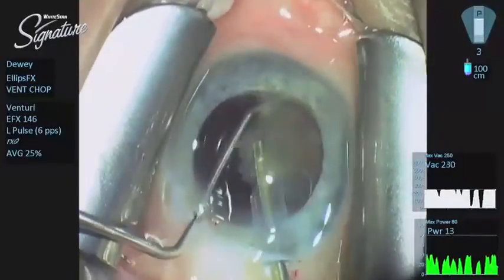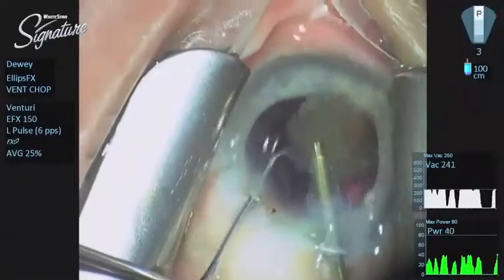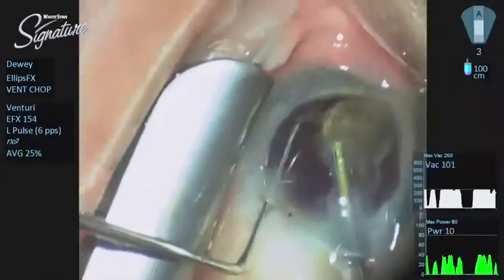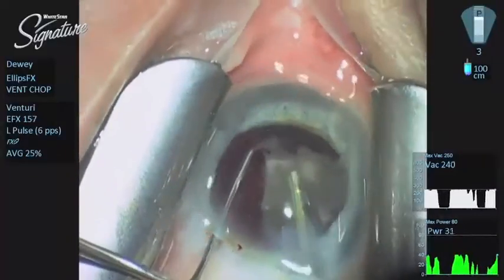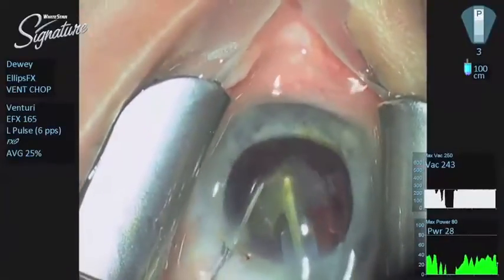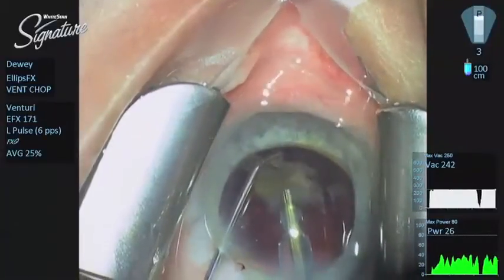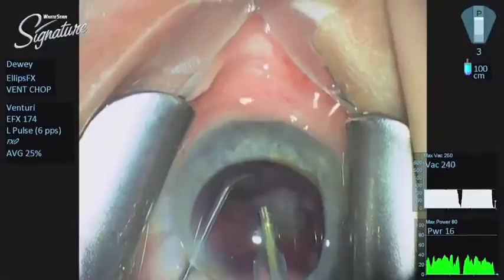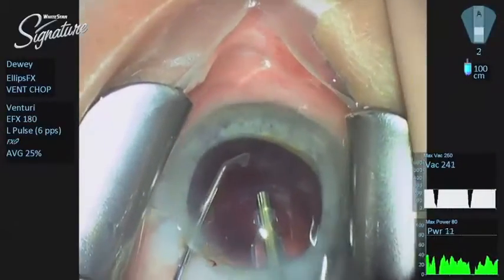That is the patient giving me something to think about — she gave a nice cough there. One of the other beauties about transversal ultrasound is the absolute fluidity with which things occur. The movement of the needle side to side actually prevents true 100% occlusion, and as a result you never get a post-occlusion surge. I am using the needle tip and the second instrument to keep the fragment from going forward in the eye, and with that it basically disappeared.